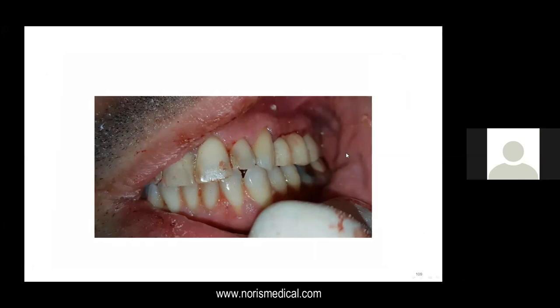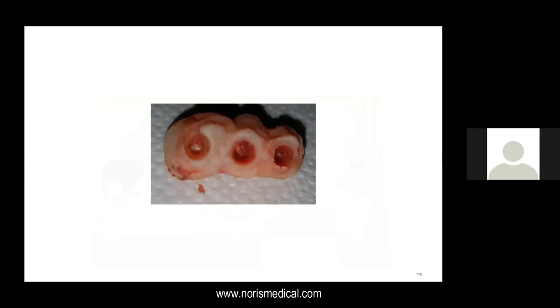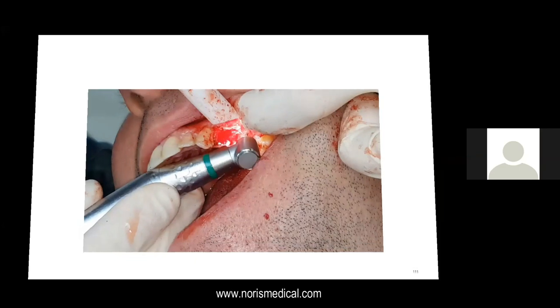Today, as I'll show you later, all the cases are done digitally. I'm gradually, happily, forgetting how to make crowns from acrylic. It is all done by 3D printers, but we'll speak about it later. This is how it looks, so you can imagine it. And this is a short movie that actually shows how it's done.